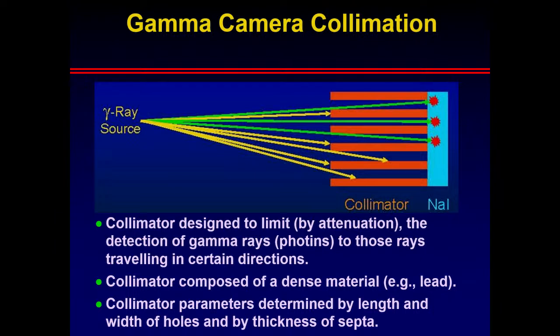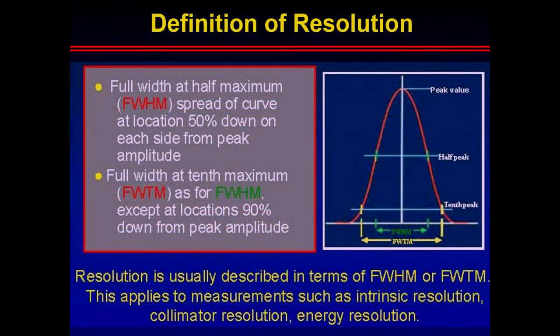The whole idea of collimators is to catch those photons that can fit through the lead septi and hit the crystal. So those photons that are most parallel to the lead are the ones that you really want to image. The rest are going to be more scattered photons.